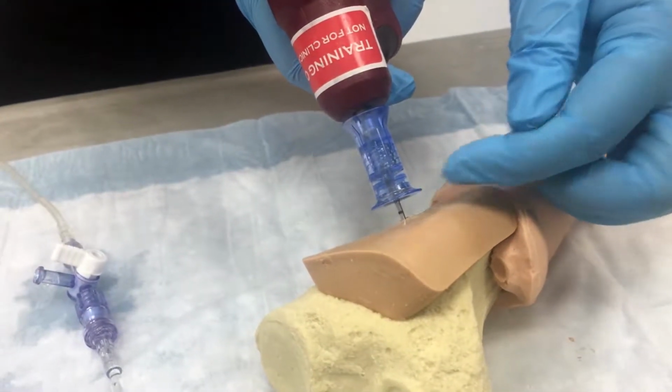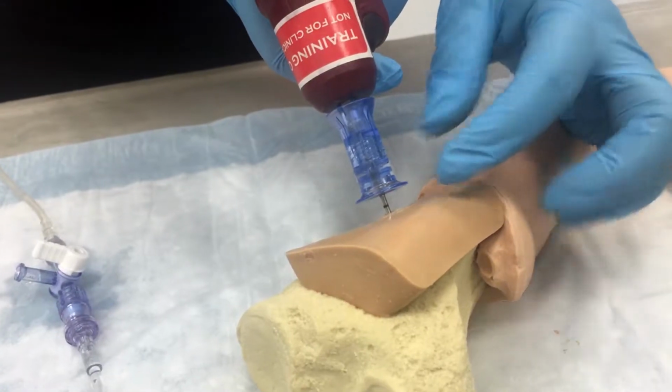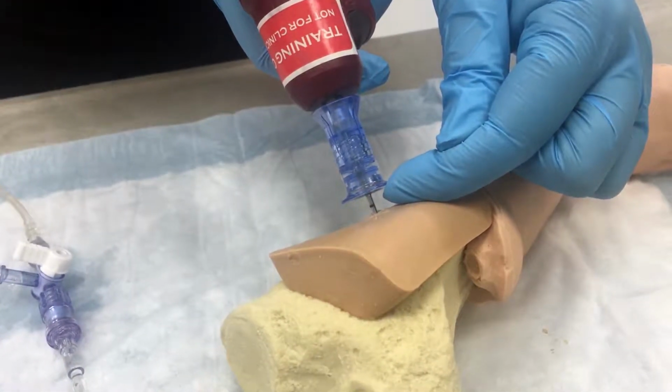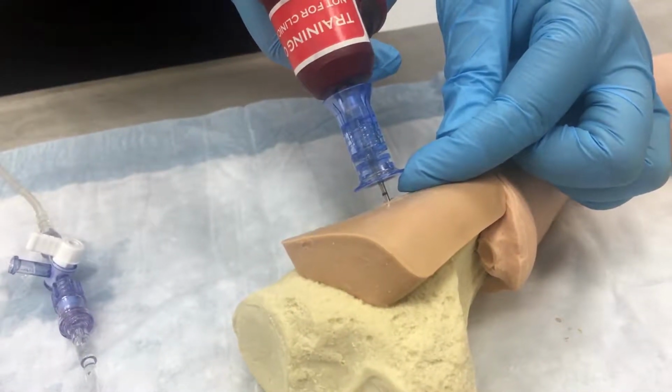The most accurate determinant of correct needle selection is use of the depth markings. Black depth marks on each catheter function as depth measuring guides to determine soft tissue depth overlying the bone.